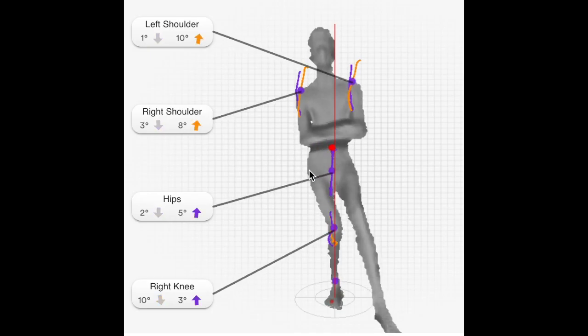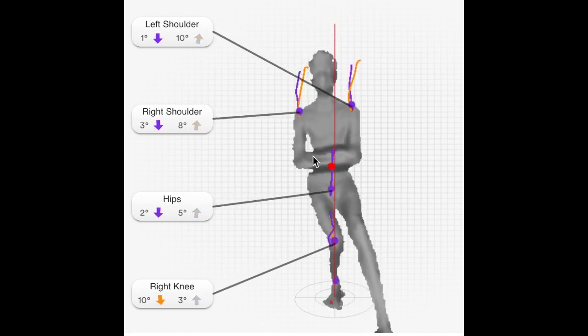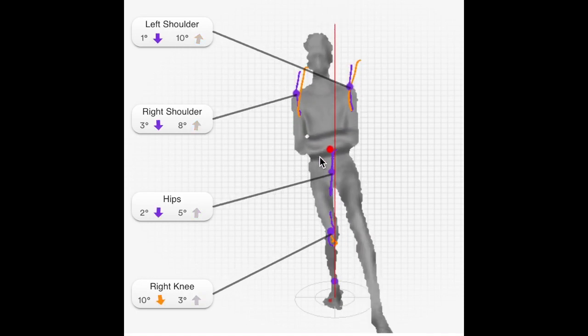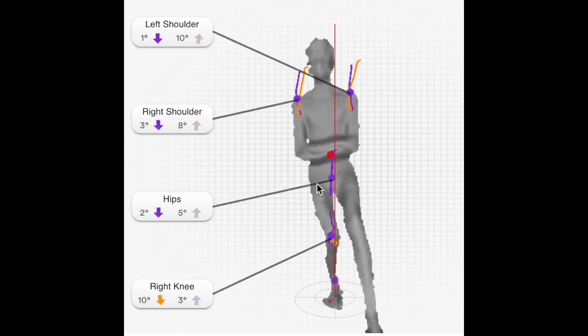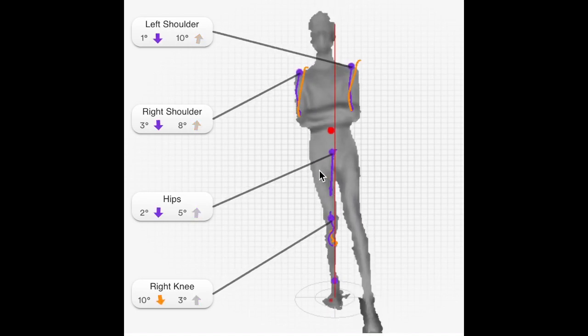In his 3D movement scan, we can clearly see instability in his right hip and how it affects his trunk stability and shoulder mechanics, confirming the importance of looking along the full kinetic chain beyond the site of pain and injury. We need to look at the whole body and treat dysfunctional movement patterns.